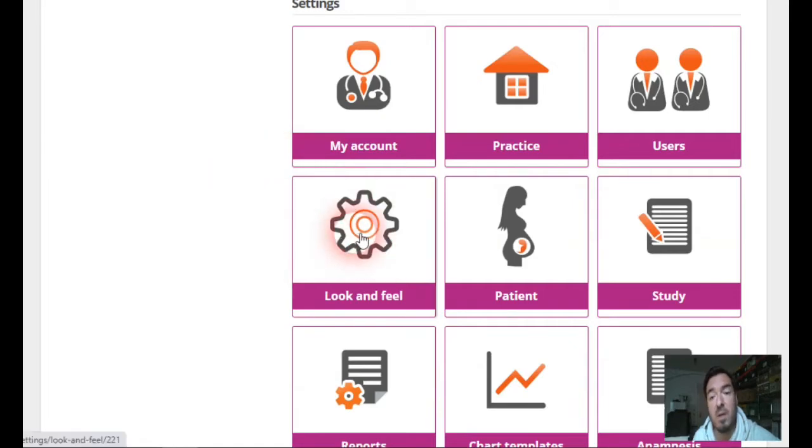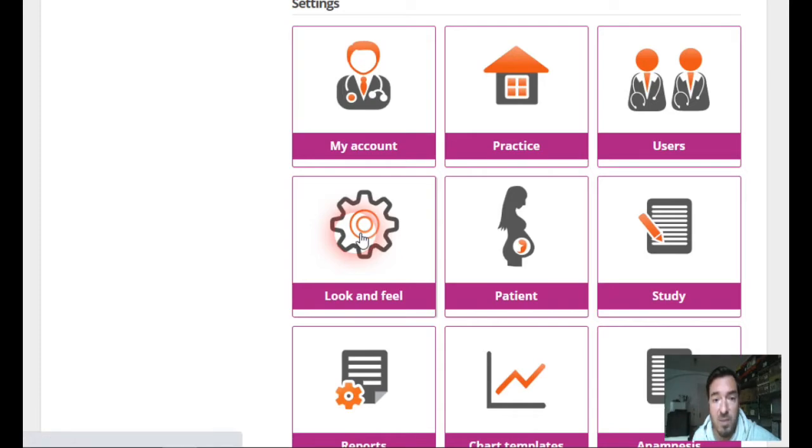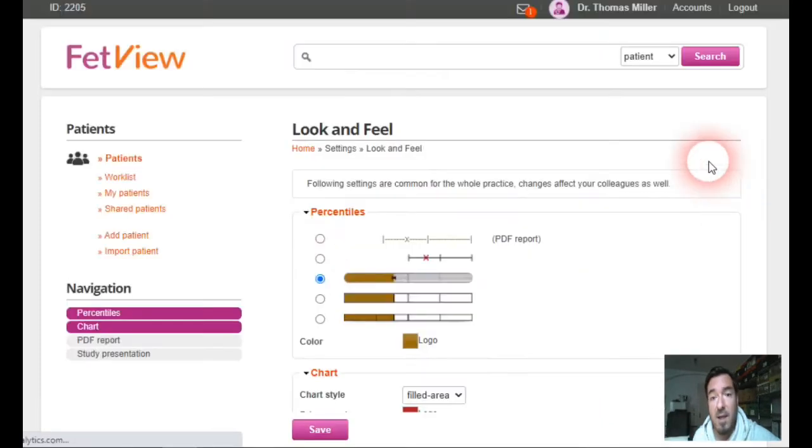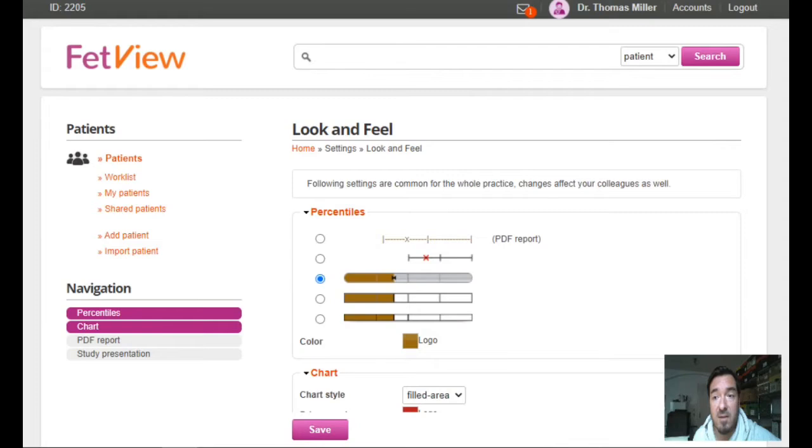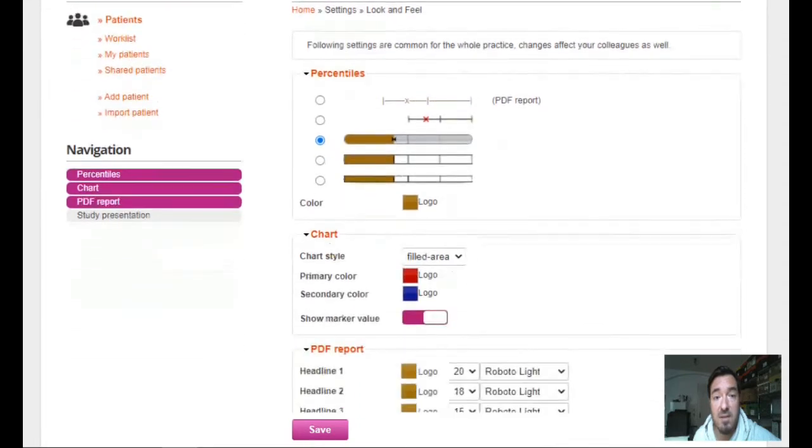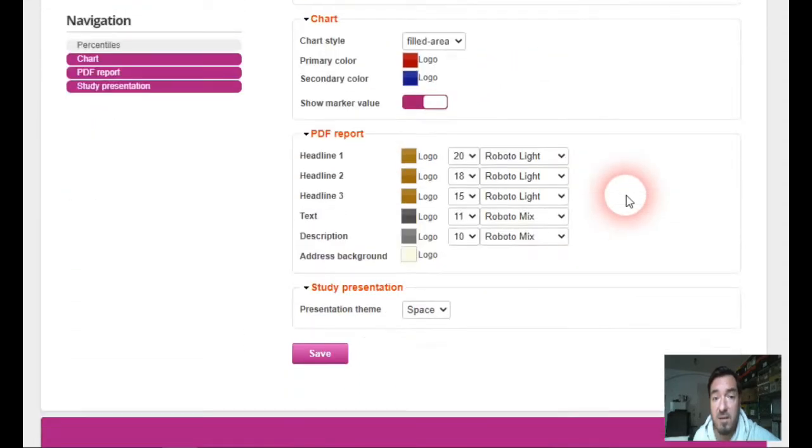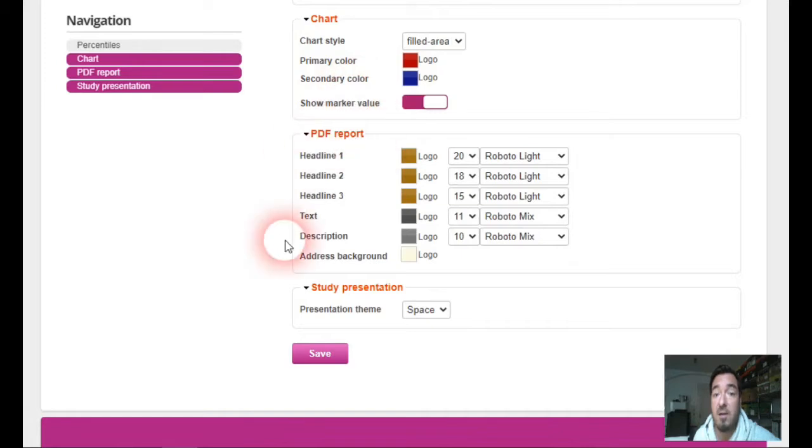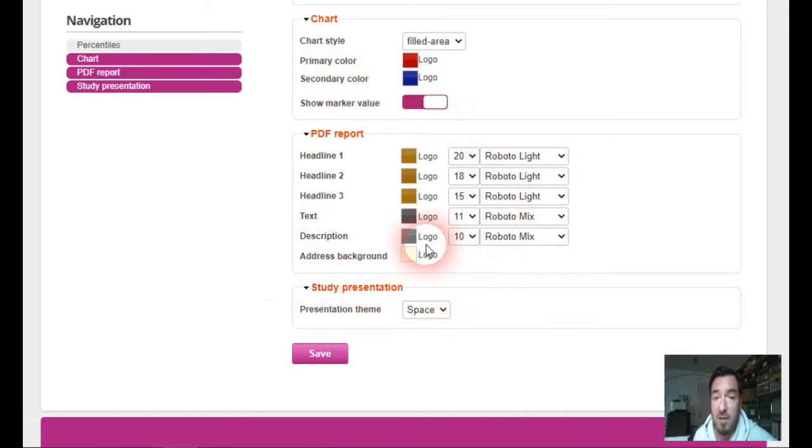This is the first field where you can customize the reports. As you can see, you can customize the style and the color of the percentiles, of the chart, and of the PDF report itself.